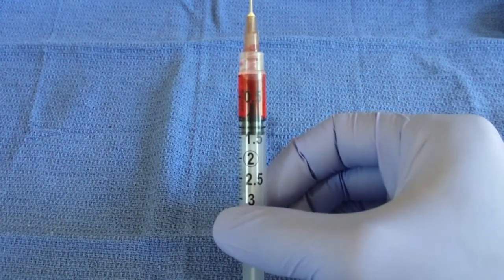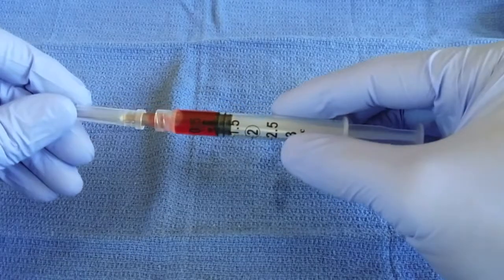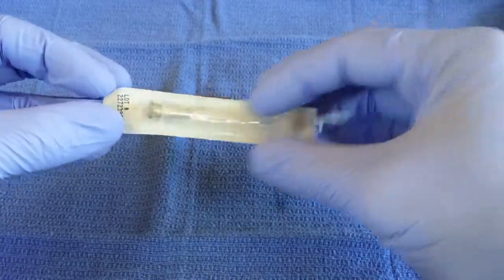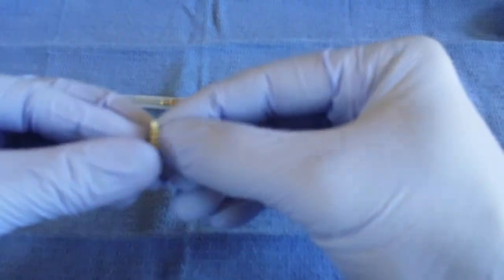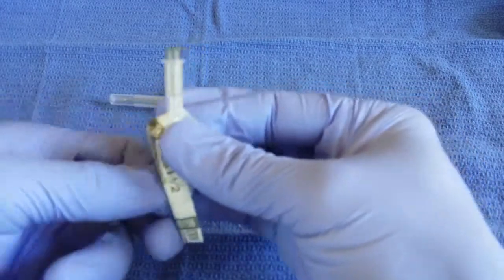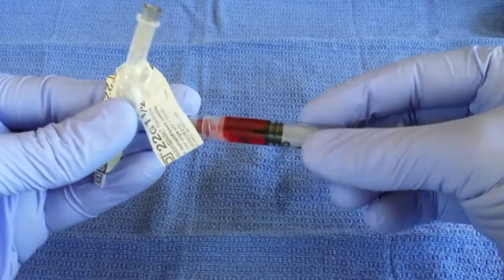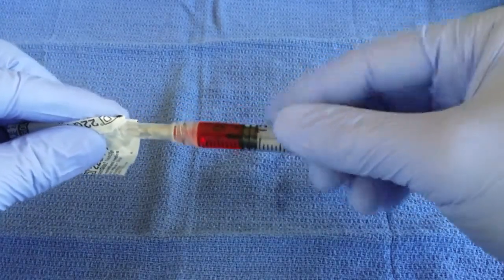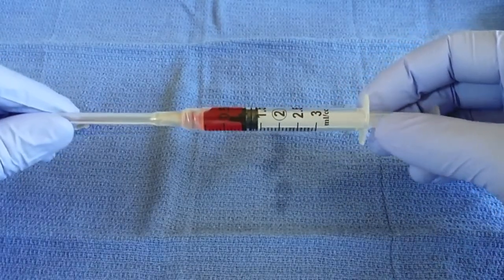Next, we're going to use the 22 gauge needle for our injection, so we will put the cap back on the 19 gauge needle, being careful not to stick yourself. We can now set that down while we open our 22 gauge needle. Same as the 19 gauge needle, we're going to open this at the end where the hub of the needle is, paying attention not to touch the hub in order to keep it clean. We can then unscrew our 19 gauge needle, attach our 22 gauge needle onto the end of the syringe, and remove the wrapping. We now have our B12 ready for administration.